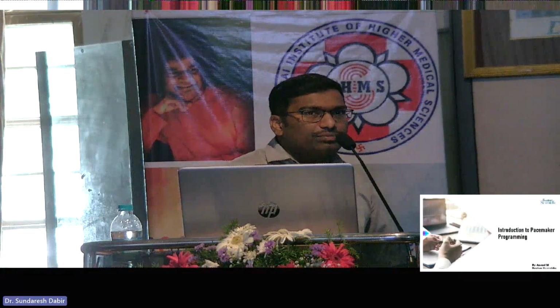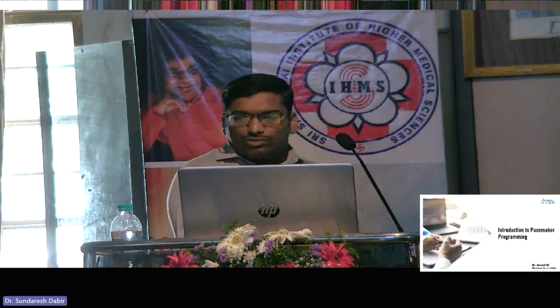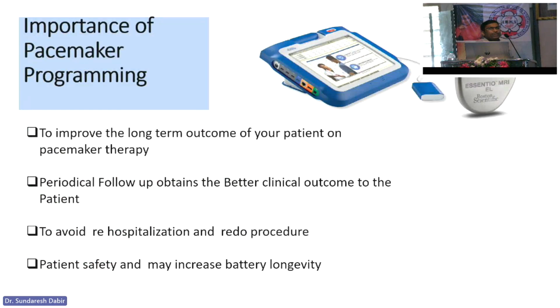So let me go through a few slides. I have very short time, 15 minutes for me, so stop me wherever you have a doubt. Okay, so importance of pacemaker programming. We require a programmer to interrogate a pacemaker, right? You can see there's a pacemaker, and there's a band that we call the RF telemetry band. Keep it on the pacemaker and then interrogate. This will communicate from the pacemaker to the programmer, whereby we can easily alter the parameters. We can change them as per the physician's suggestion. So whatever parameters are required can be changed.